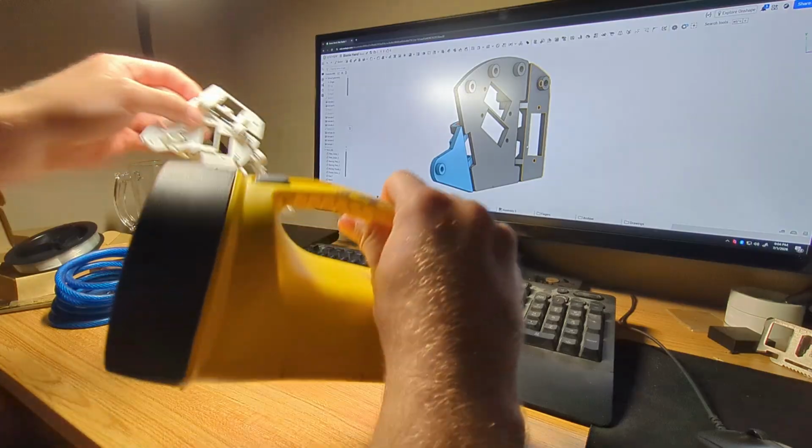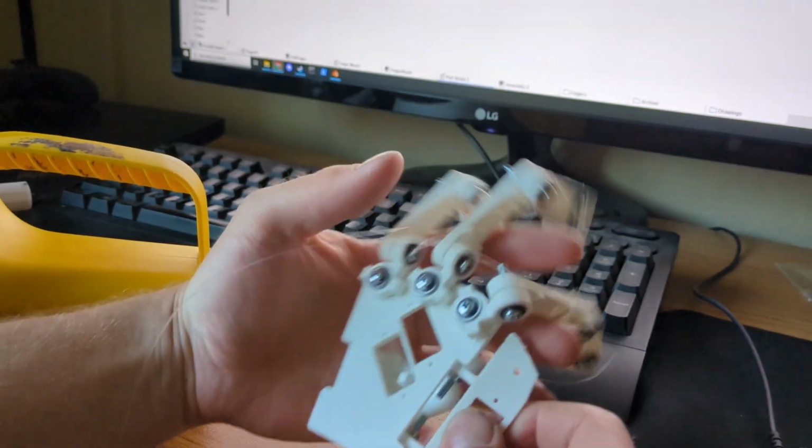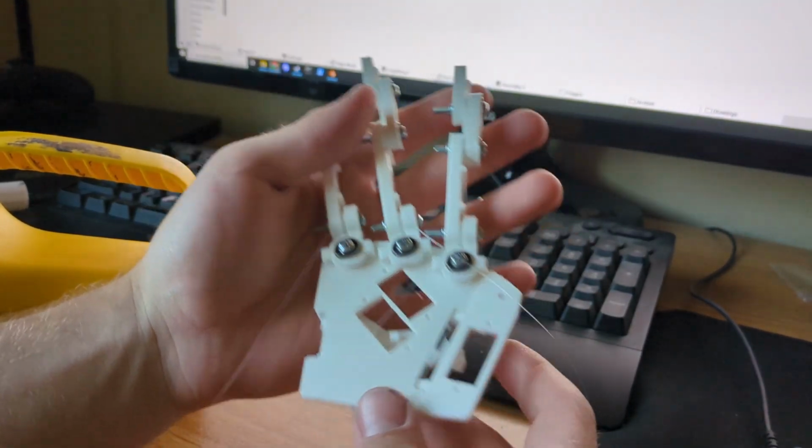So I'm gonna change the hardware. Other than that, there it is. That is V1.